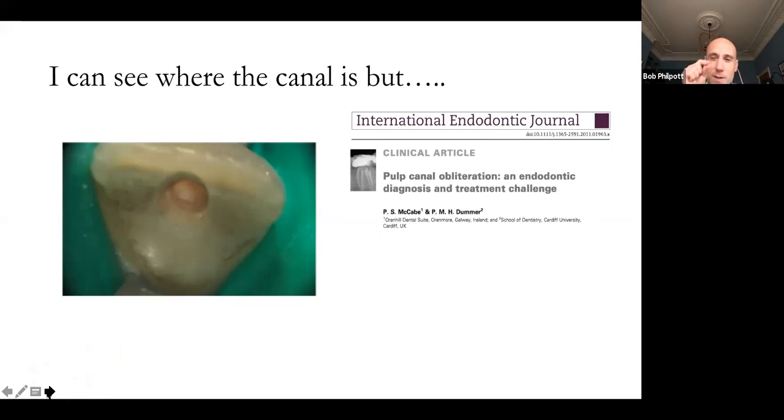or that little tiny, it's not a dot, because remember, the canal was big at some point, and then it calcified and calcified and calcified, but it didn't all calcify into one dot. They calcify in different ways, and there are dystrophic calcifications that occur. So just look for something that looks a little bit different and say, well, okay, and don't be afraid as well.